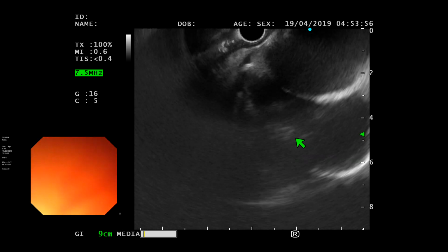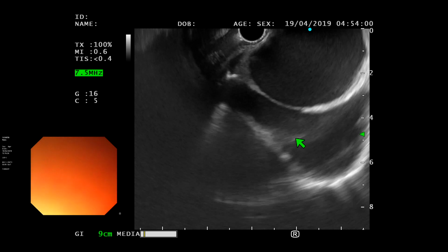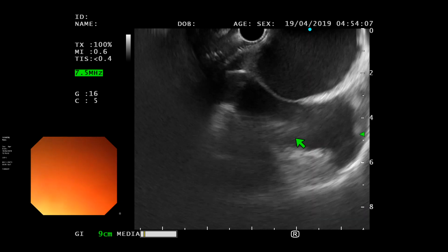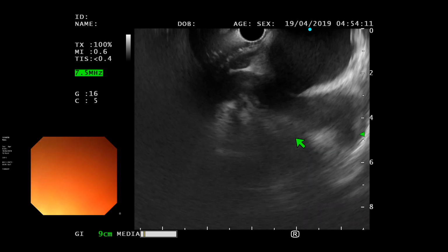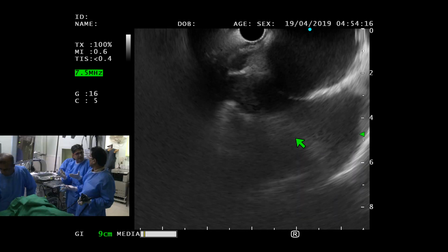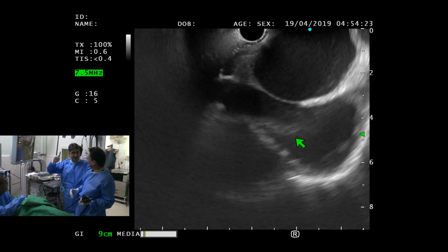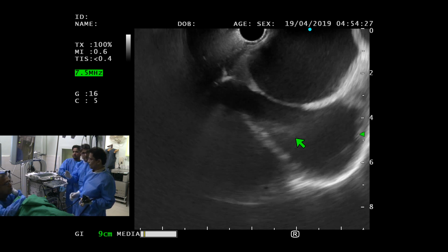Stop. Once the heart is finished, we already know that we are now entering the territory which is the abdominal cavity, right? So the end of the heart gives us certain information that we've progressed further, becoming the end of the thoracic cavity, and we're about to start the abdominal cavity, because we know that the end of the heart actually sits on the diaphragm. Would you agree with that? Right? Okay, good. So already I know that I'm entering. So the next structure which is my first landmark, looking at the interior of the patient, right? Is what?